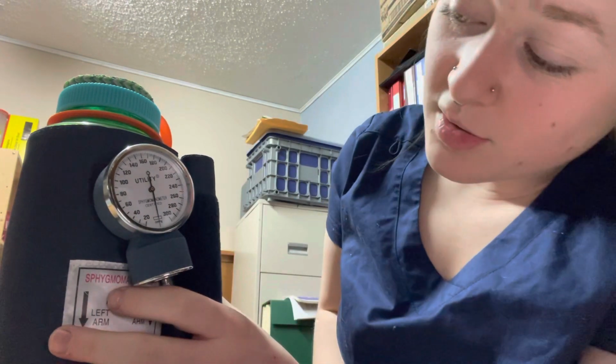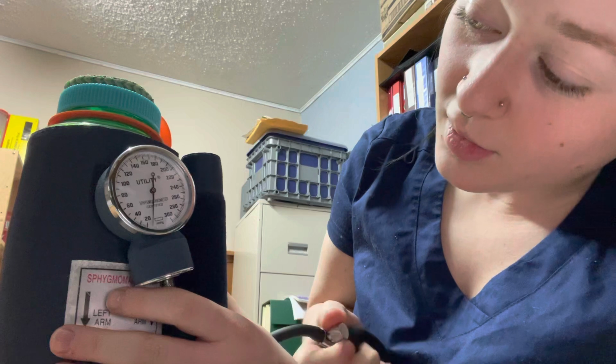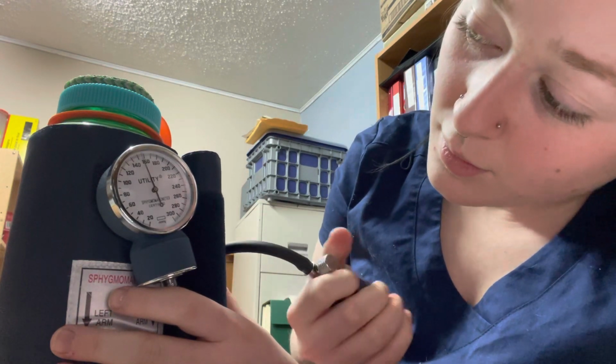So, what I'm going to do now is I'm going to inflate it until I can, in theory, no longer feel the pulse. The number value that I'm going to assign to that is 170 millimeters mercury. So, I'm going to make sure that my pump is closed, and I'm going to start inflating it. Okay, so now it's at 170.